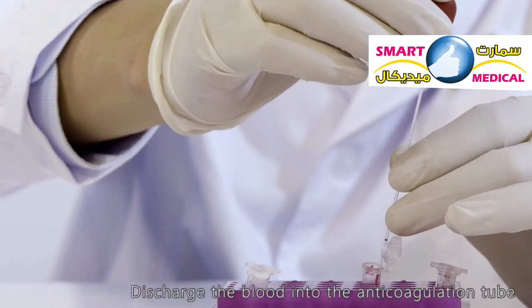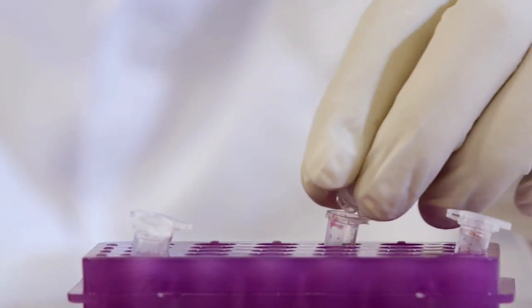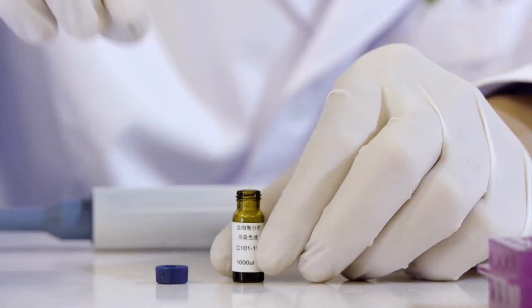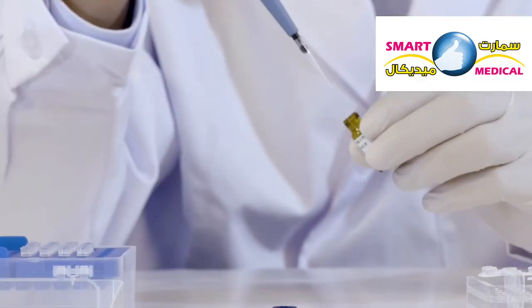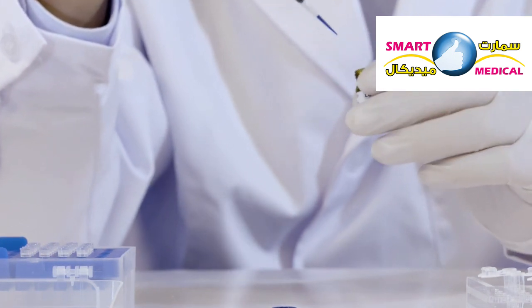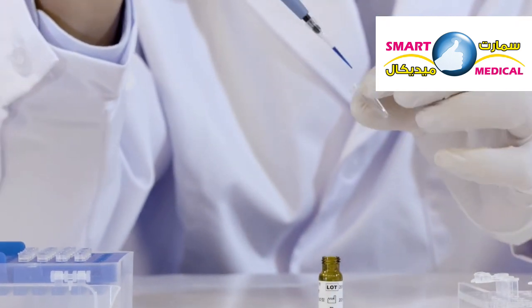Discharge the blood into the anticoagulation tube. Open the staining solution. Absorb 10 microliters of the staining solution and transfer it into the micro centrifuge tube.